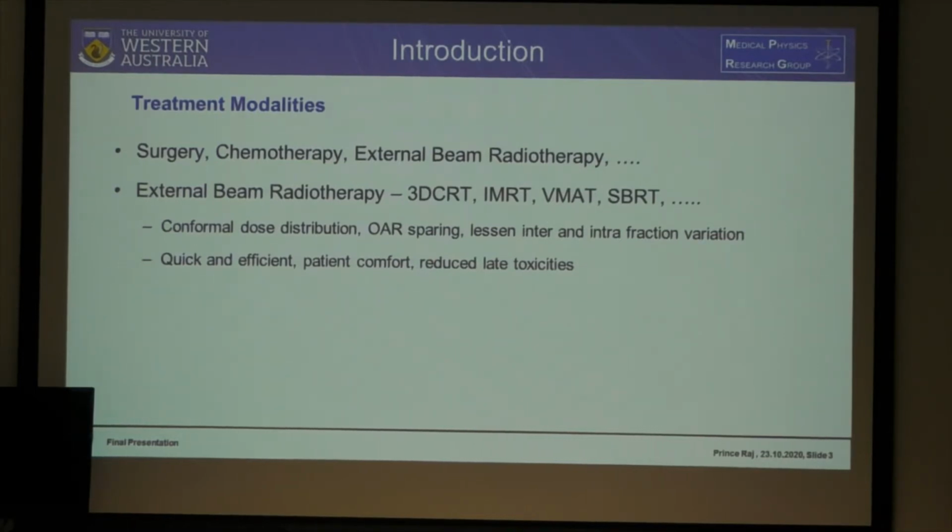The reasons are their conformal dose distribution, organ sparing, less intrafraction and interfraction variability, and so on. Also, from a dosimetric point of view, it is quick and efficient, it gives comfort to patients and reduces late toxicities, in terms of the QA process.